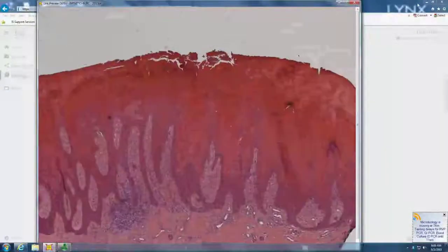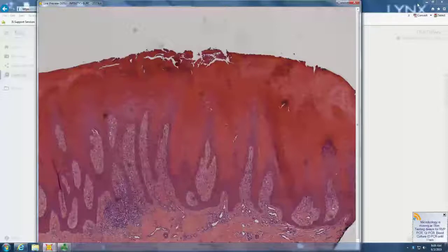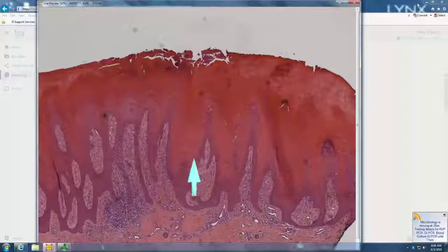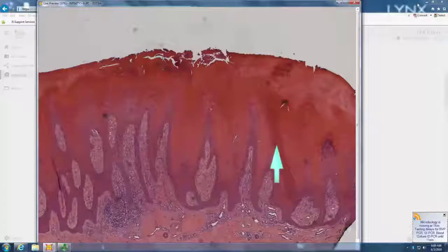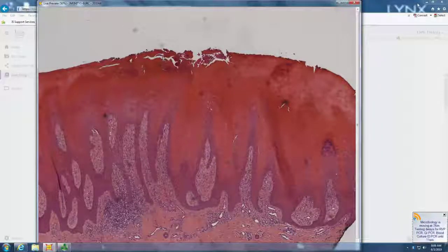So we have a really thick epidermis, erosions, crust formation, a lot of dead red cells, V-shaped rete. So what is this? Verruciform xanthoma, wart on fire, multiple red V's with neutrophils in the epidermis. And if you don't see that at scan, you're never going to make the diagnosis looking higher.